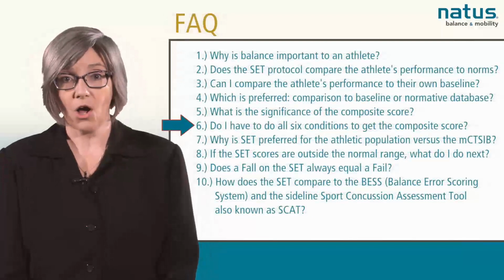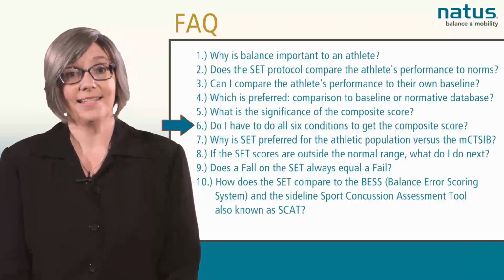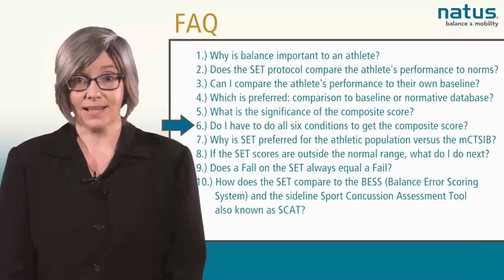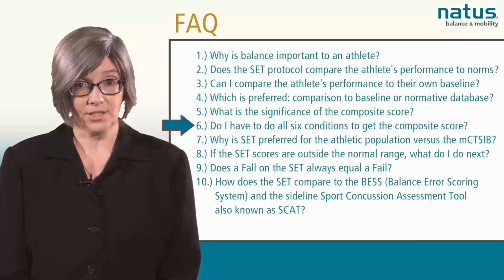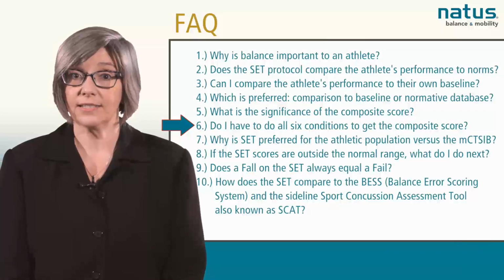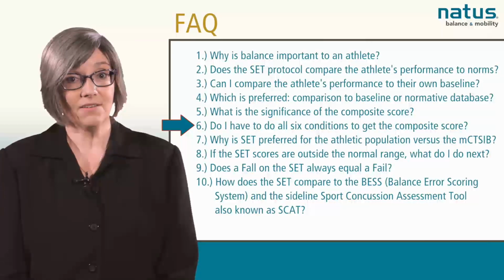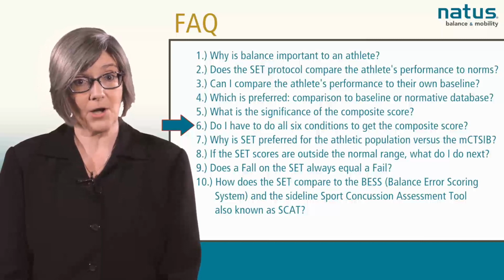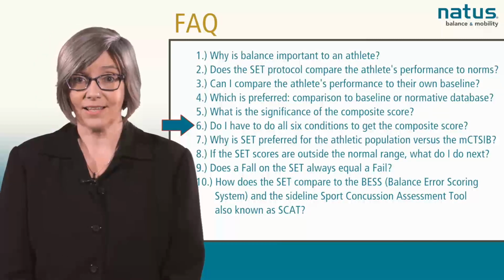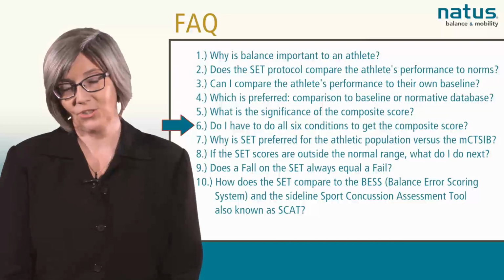Do I have to do all 6 conditions to get the composite score? Yes, the test has been designed to allow the clinician multiple trials in different positions to identify postural instability. This redundancy increases the reliability of the test and increases the chances of identifying subtle impairments. This process will help increase the safety of the athlete as return to play decisions are made.